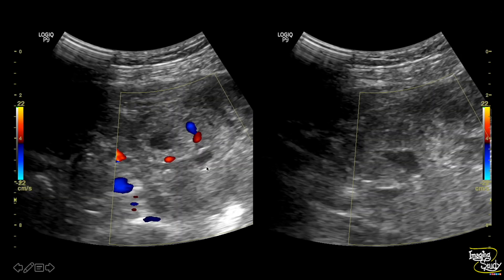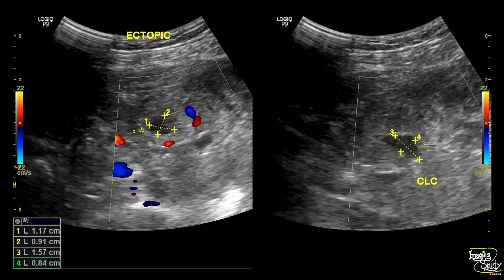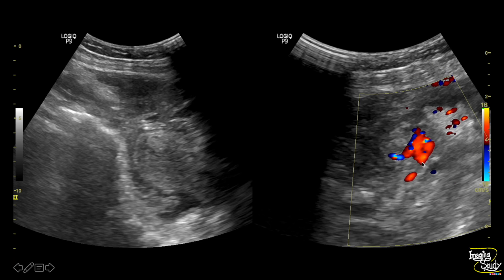Here is another glimpse showing the ectopic pregnancy on the left and the corpus luteal cyst on the right. Here is another picture of part of the uterus and the heterogeneous collection, along with the prominent vessel on the right which was supplying the ectopic pregnancy.